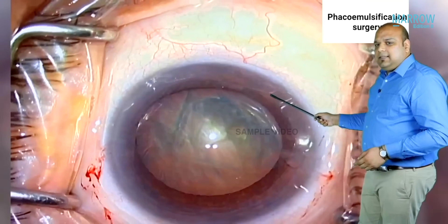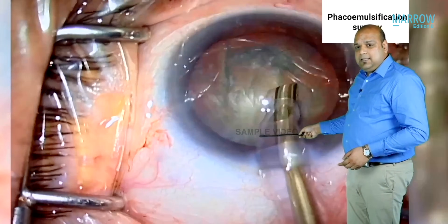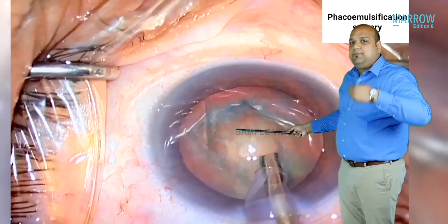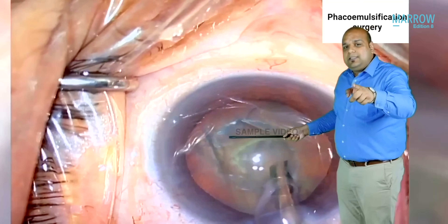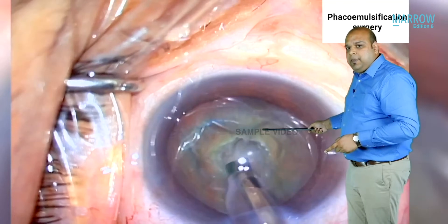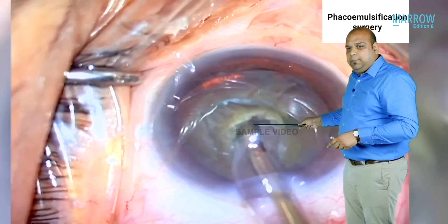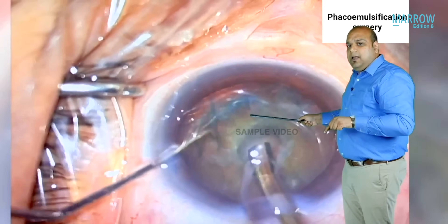The surgeon inserts the phaco probe — a pen-like structure. Through this probe the nucleus is removed. The phaco probe has three functions: irrigation (replacing fluid as material is removed), aspiration (suction), and phacoemulsification (ultrasound energy). You can see the ultrasound energy creating a groove in the nucleus — like eating a cake. At the tip of the probe, the ultrasonic energy converts into to-and-fro motion, effectively chiseling the material.